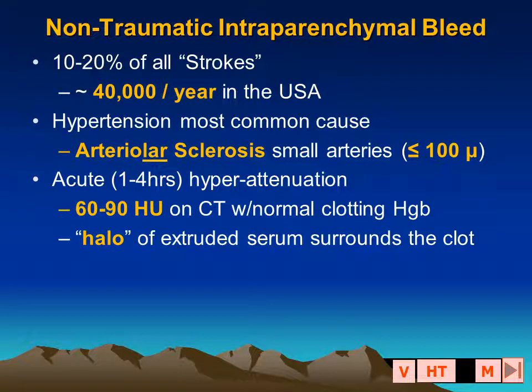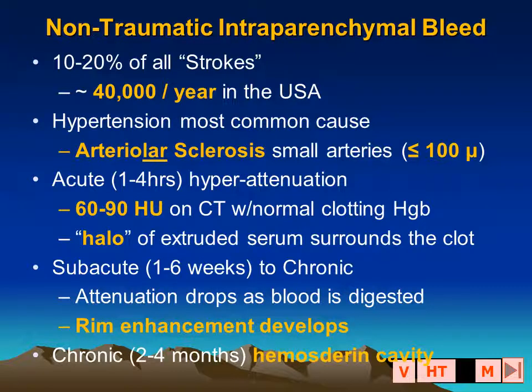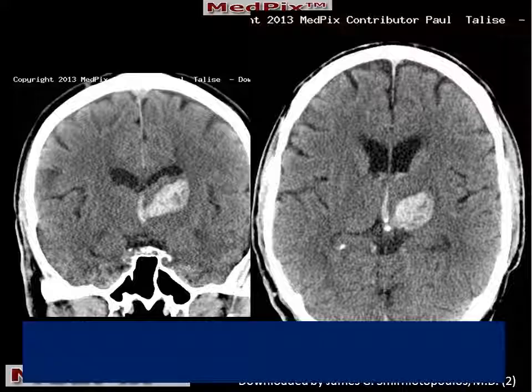An acute CT scan demonstrates a hyperattenuating lesion. Subacutely, we can have degradation of the blood products, changing their attenuation and signal intensity on various MR pulse sequences, and there may be development of rim enhancement after a week or two surrounding the hematoma. A chronic hematoma becomes a slit-like cavity with hemosiderin deposited in the rim, which can be easily identified on several pulse sequences on MR.